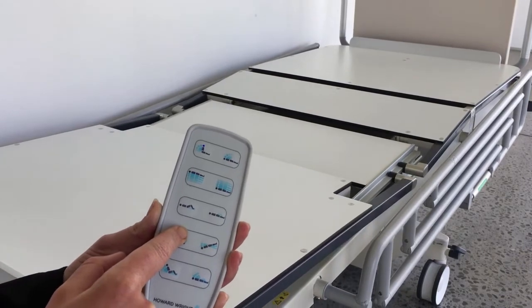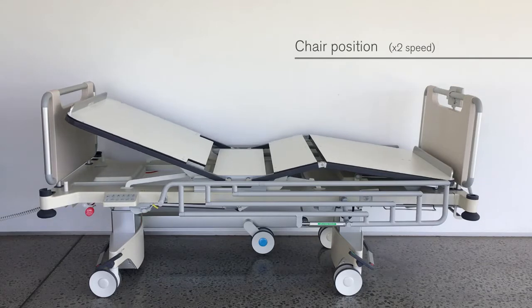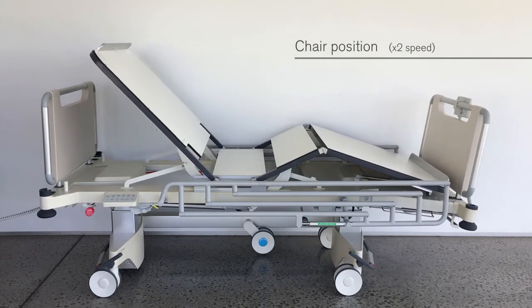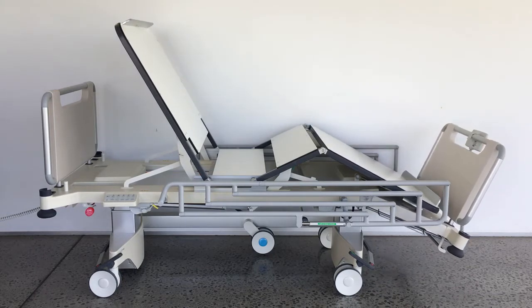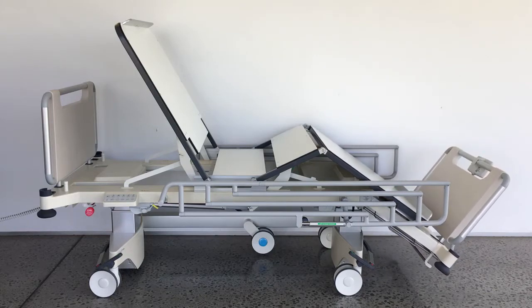To form a chair position, press the chair up button. To achieve the full chair position with the bed at a relatively low height, ensure that the bed extension is latched fully in and the linen rack is properly stowed. To flatten the deck, press the chair down button.